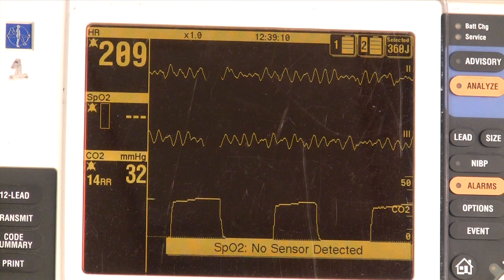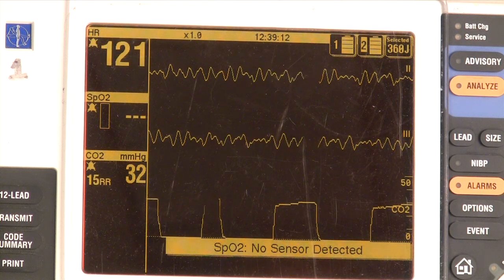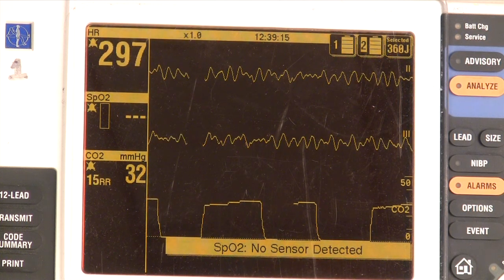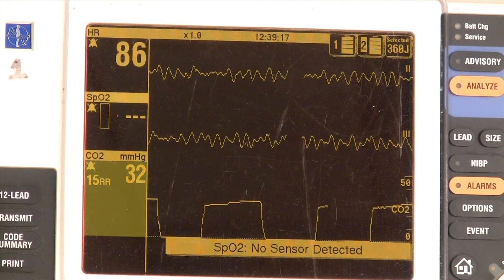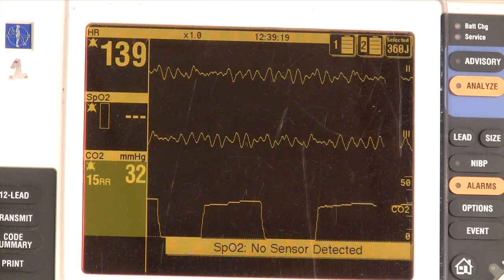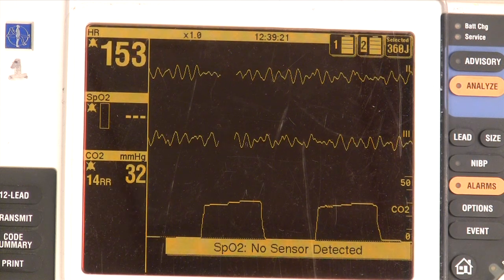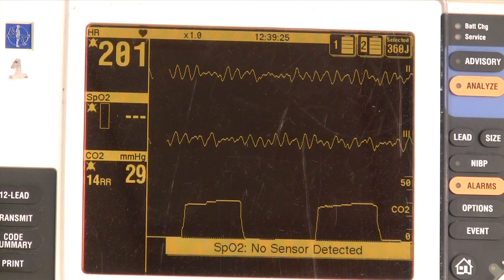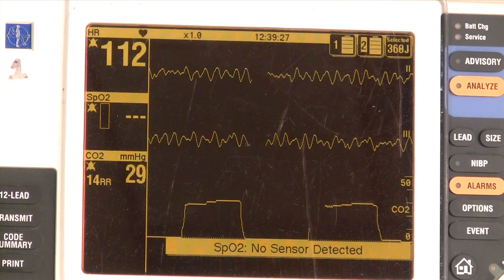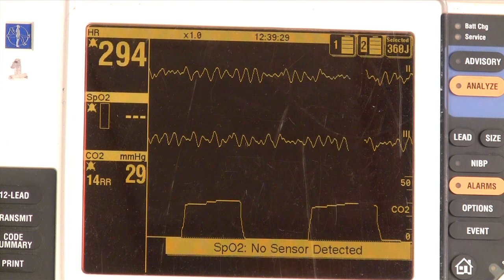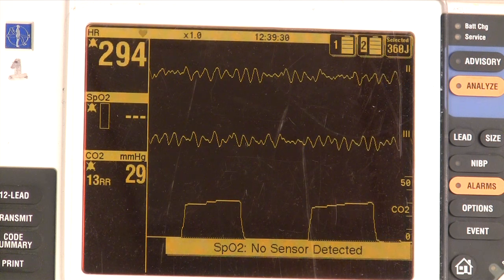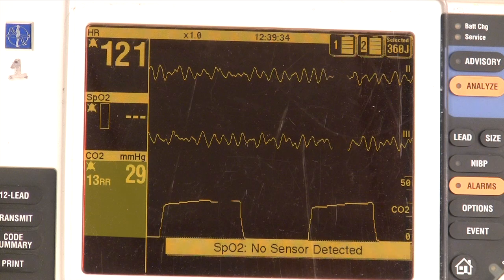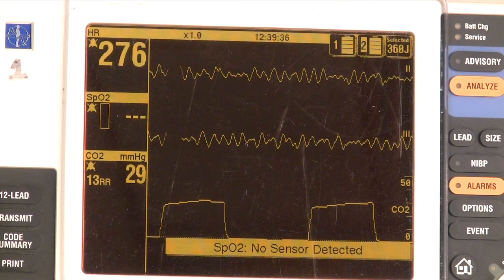In the cardiac arrest patient, we use capnography to measure whether we're doing compressions adequately, in which case we should have expired CO2 of at least 10. We also use it to measure whether or not the patient has a perfusing rhythm or has the return of a pulse despite the fact that we can't feel it. Once you have a return of spontaneous circulation, you'll have a spike in capnography to at least 40, at which time you can stop compressions.